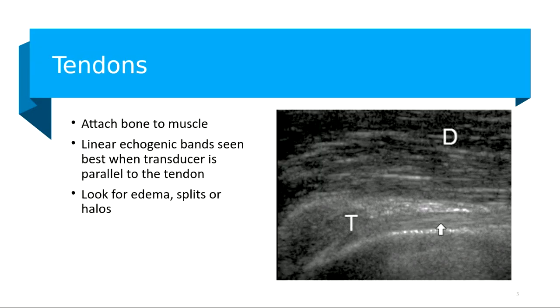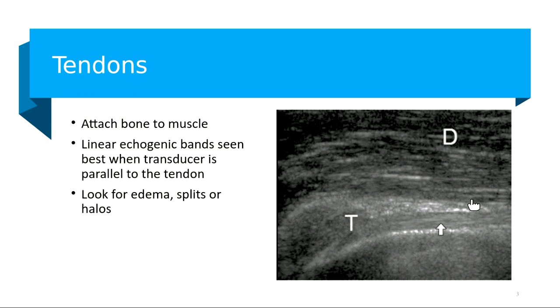Tendons are a little bit more difficult. If you're a general sonographer, you may not have the frequency or the probe that you need to appreciate the detail of the tendons, but you can see that the tendon is like a bunch of bright bands where they're pointing to the arrow. A tendon connects bone to muscle — it's linear echogenic bands that are easier to visualize when the transducer is parallel to the tendon.